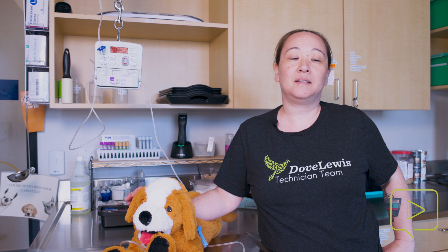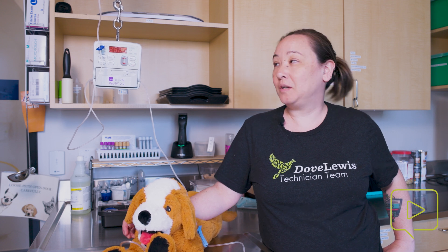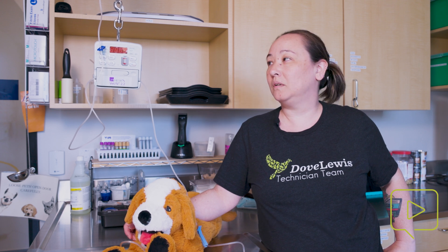Hi there, my name is Connie. I'm a CVT here at Dove Lewis, and today I'm going to talk to you about Heska fluid pump troubleshooting. There are a bunch of different alarms that will go off throughout your day, and I'm going to go through the most common alarms and how to troubleshoot those.